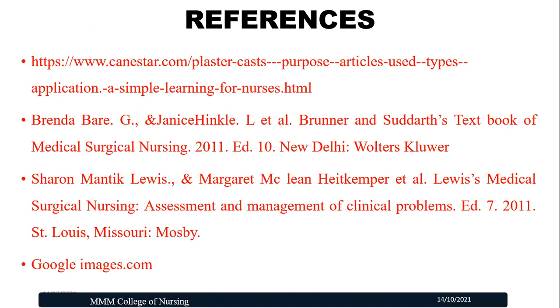And some of the take-home messages with this: cast application is a process which is usually done by trained medical personnel, but nurses have a very, very important role to make the patient comfortable before application of the cast, help the patient during the process of setting or drying the cast, teach the salient features that the patient needs to do and not to do when wearing the cast, and monitor for the complications. The main thing that needs to be monitored during POP application is the neurovascular assessment. You can refer to the previous video, which explained the neurovascular assessment in detail.